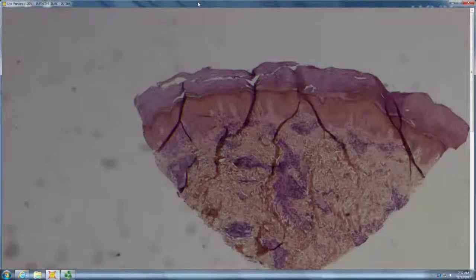Okay, sorry, Caleb. Like a patchy perivascular kind of infiltrate. Yeah, so patchy perivascular kind of infiltrate. Where on the body do you think you are? Maybe acral skin? I'm thinking probably not acral, just because the corneum's not quite thick enough. We may be like dorsum of an arm. We could even be a hand. So I guess acral is in there. Certainly not volar, but acral. And then there is some fluffy edema.